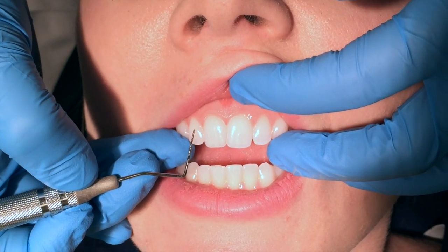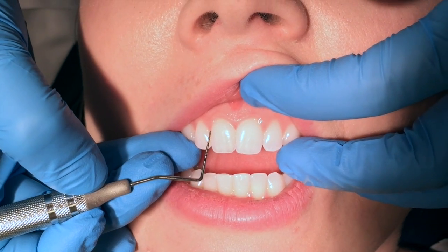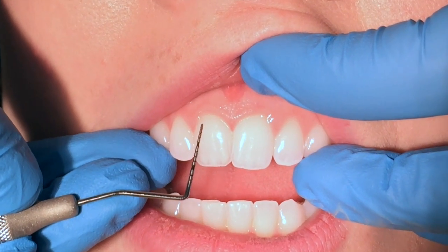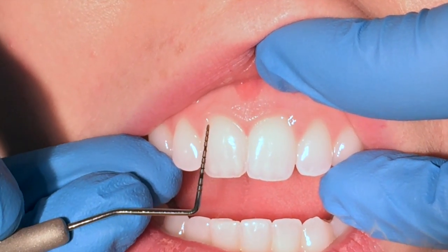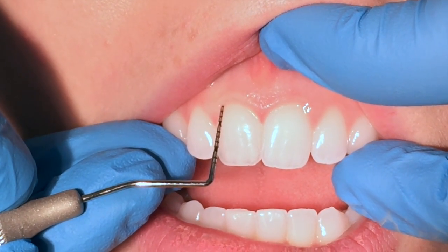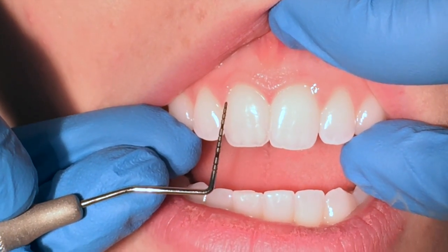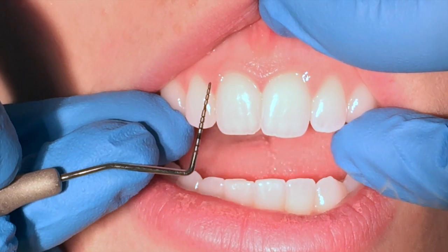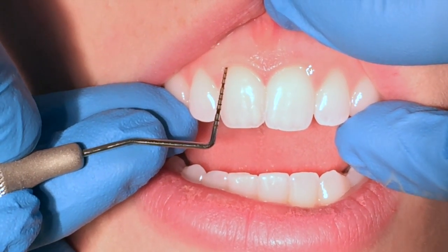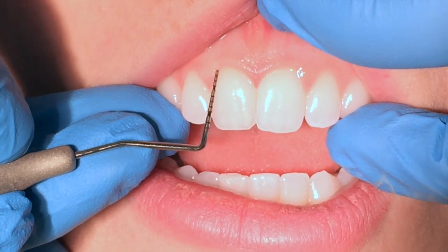Evaluating the pocket depths on a healthy patient, you know that you are getting it deep enough when the tissue blanches. So here on Candy — she takes really good care of her teeth — when I insert the probe keeping the last two millimeters tight against the tooth, when I see that sulcus blanch, I'm deep enough. It's a really light grasp. You want to make sure that you're not pushing against that junctional epithelium. Just gently slide in until you feel some resistance, and you will see that blanching and get a correct probe reading.